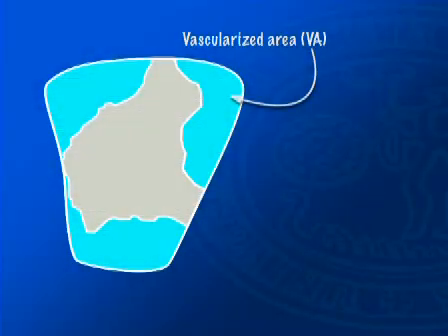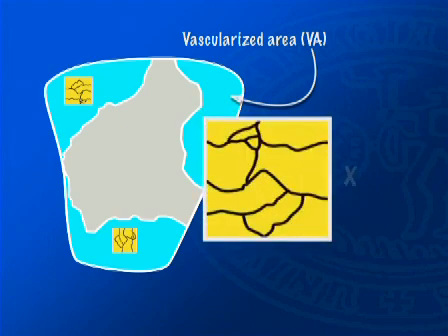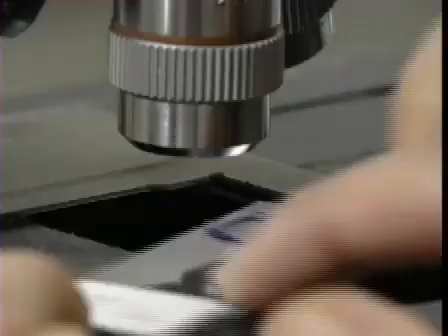The next step involves recording the microvessel density and pattern formation. Within 3 central parts of the vascularized areas of every window, these parts are systematically chosen at random at an optical enlargement of 80. Each vessel is visualized as a single line using a drawing microscope.